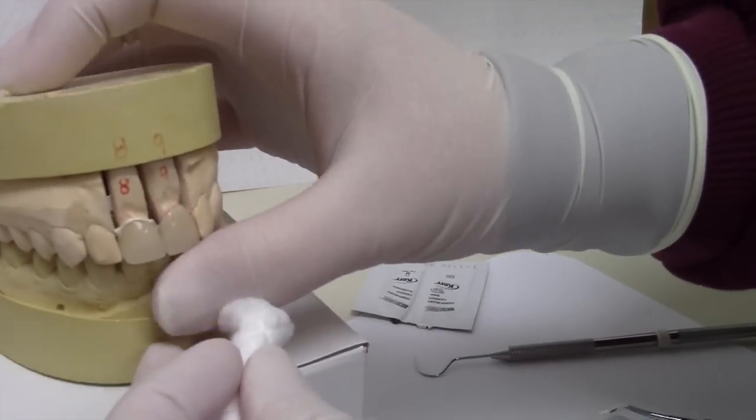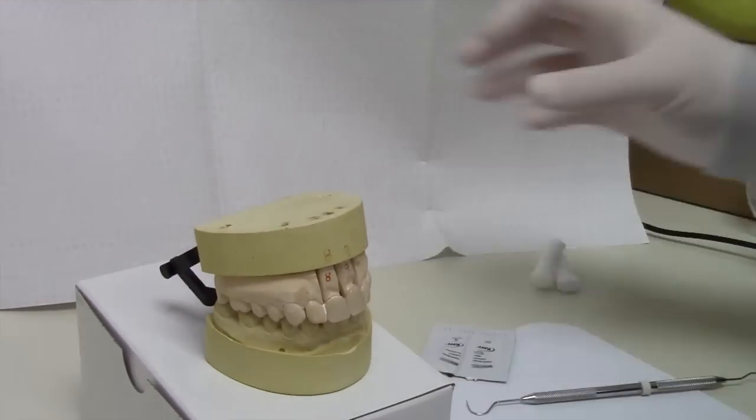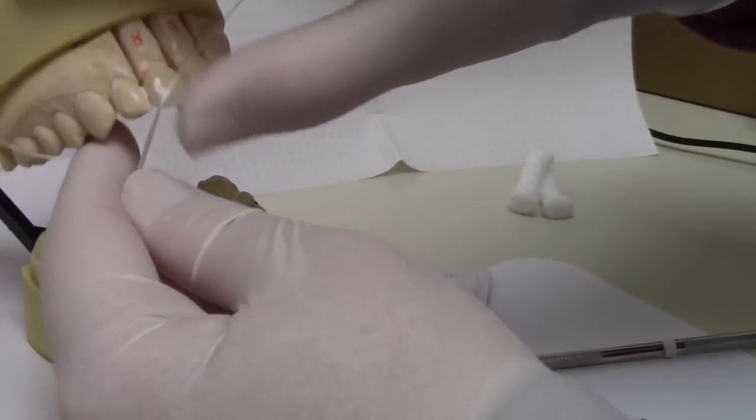After cement has hardened, clean around the tooth, removing any extra cement. Floss as recommended by inserting floss between teeth like normal, then slide the floss out.